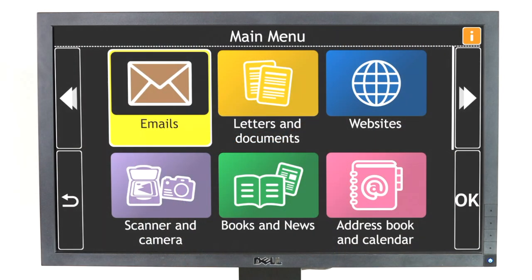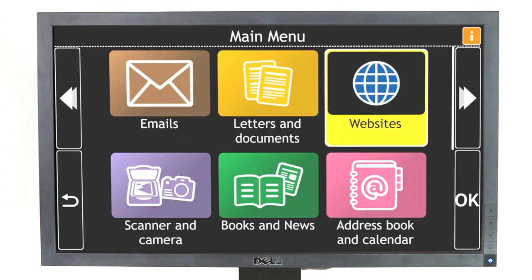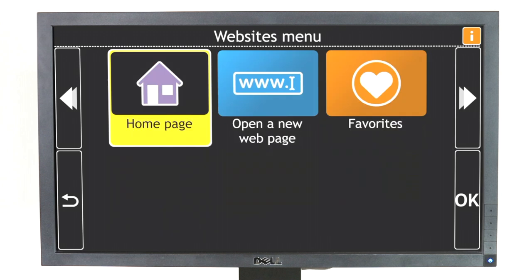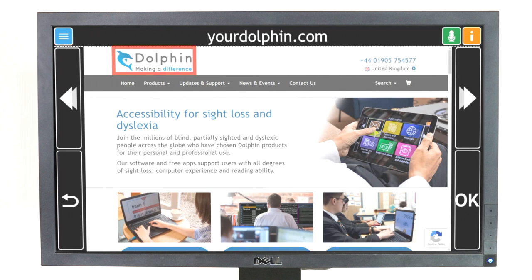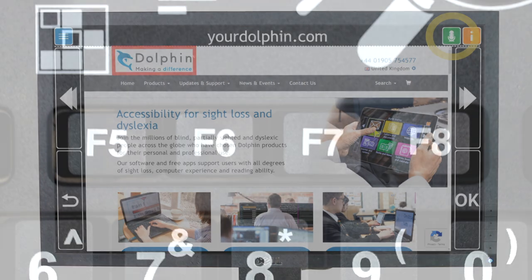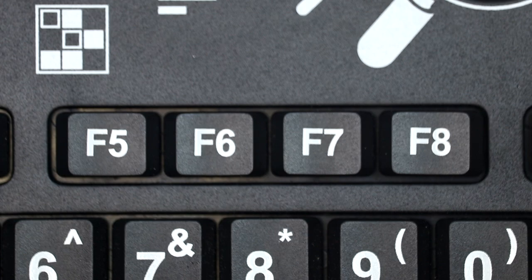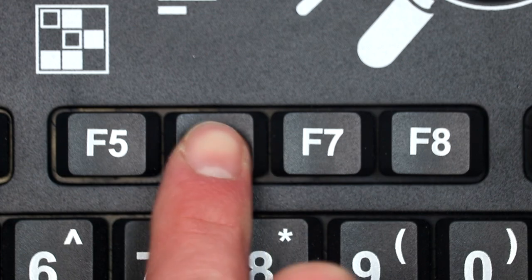You can use Voice Input to search for questions and answers on the internet. First, select the Websites item from the main menu, then select the Homepage item. GuideConnect will open a new webpage and the green Voice Input button will appear near the top right of the screen. Select the Voice Input button and ask the question or query you would like to know.